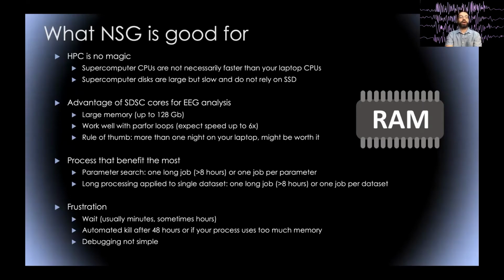And so the process that benefits the most from NSG is parameter search. For example, you have an algorithm and you want to optimize a given parameter, where you're going to have to run lots of jobs.